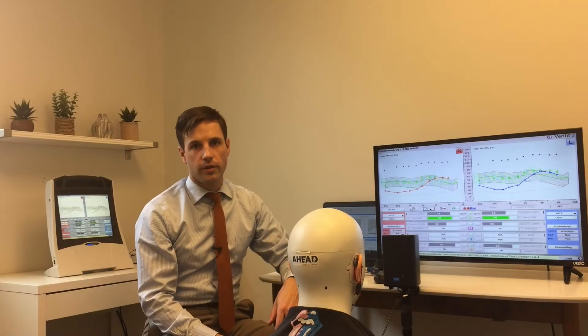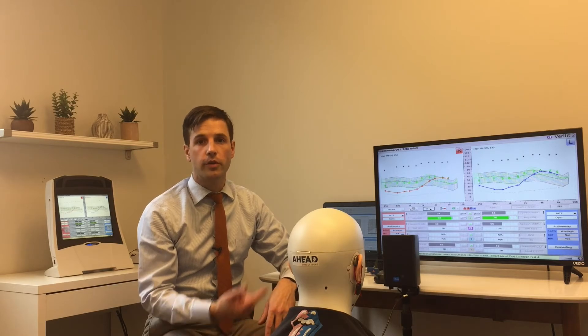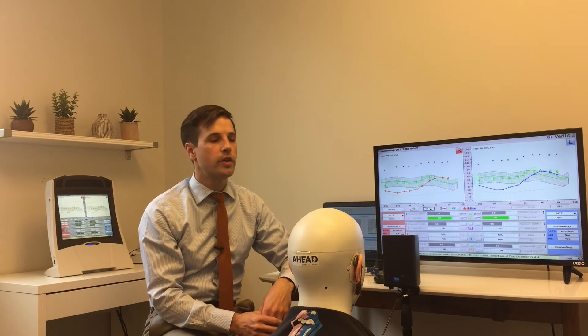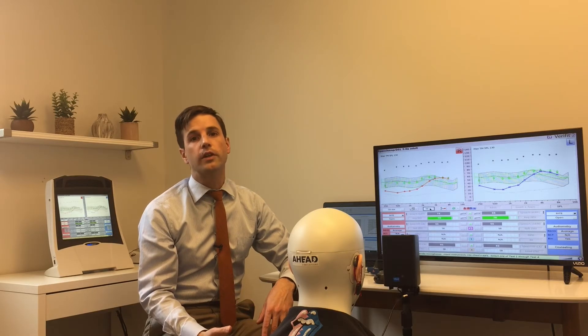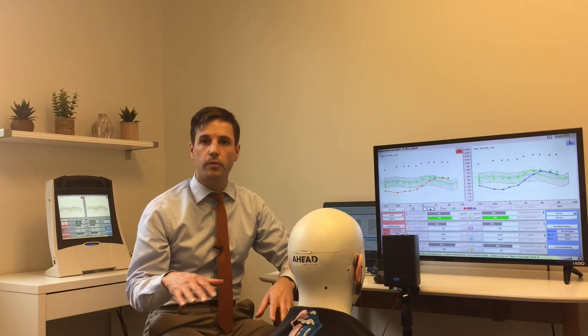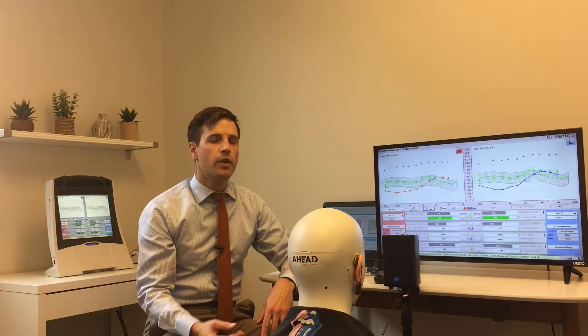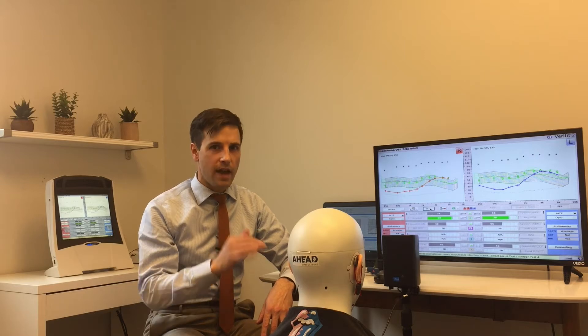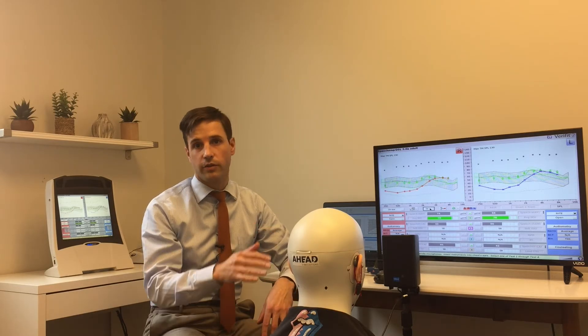A quick note on running an unaided curve: sometimes it's desirable to do so even though the Verifit gives you an average — especially if you're going to block off the ear. For example, if someone should be fit with an open fit hearing aid but wants to go with a closed fit like a CIC, you really want to know exactly what's happening in the ear canal before you block it up, so that you can match the response.